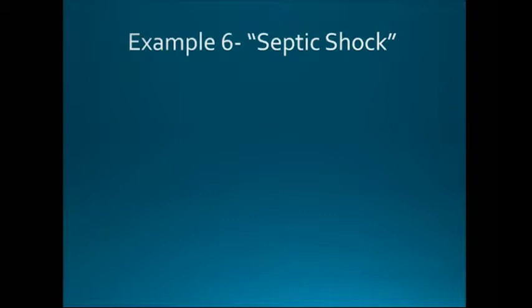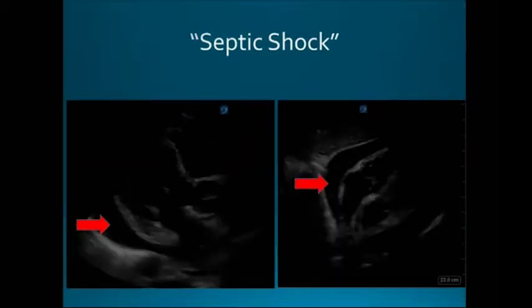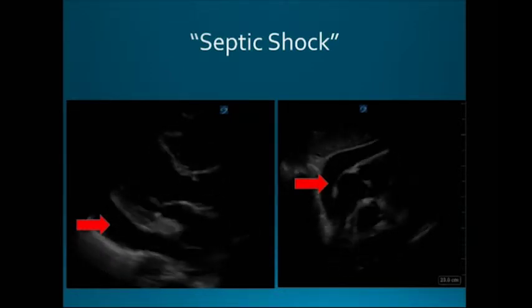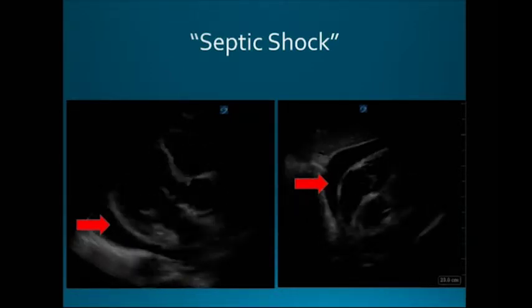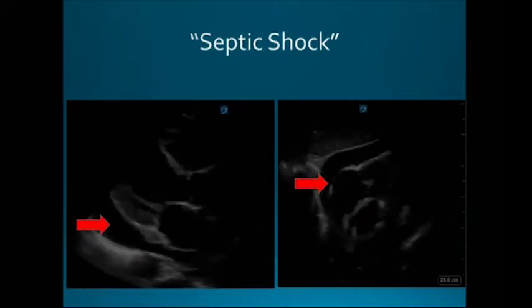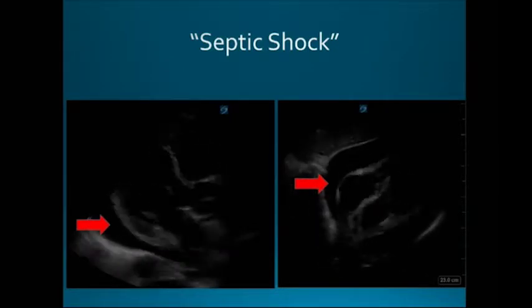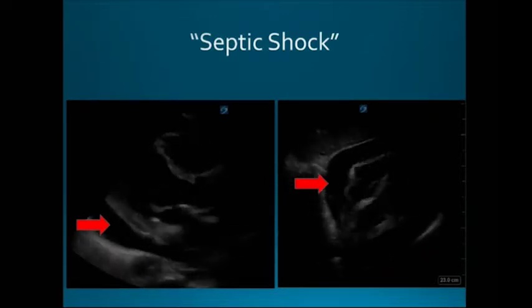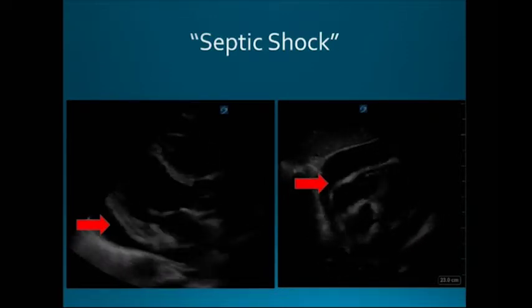But as part of every single evaluation, he evaluates everybody with an ultrasound of their heart if they're in shock. And when he looked at this person's heart, now unfortunately this did not project very well, I'm sorry, but when he looked at the image of this guy's heart, this is the heart right here. And then this is the outside portion of the heart right here. This is the end of the myocardium. And you see how there is black around the myocardium here?